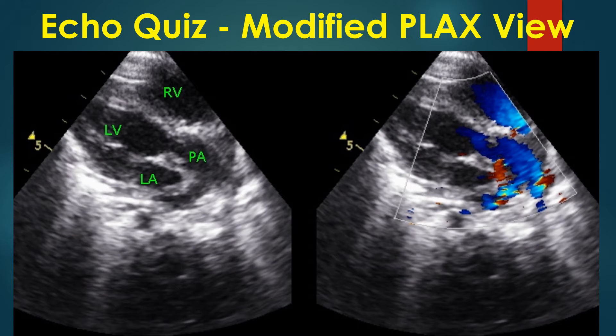Findings are easy to appreciate as it is an annotated image. The Parasternal Long Axis View is often the first view taken during echocardiography. Usually it visualizes the left ventricle, left atrium, right ventricular outflow region, and aorta. Here we have a modified parasternal view to trace the great vessel arising from the left ventricle distally.